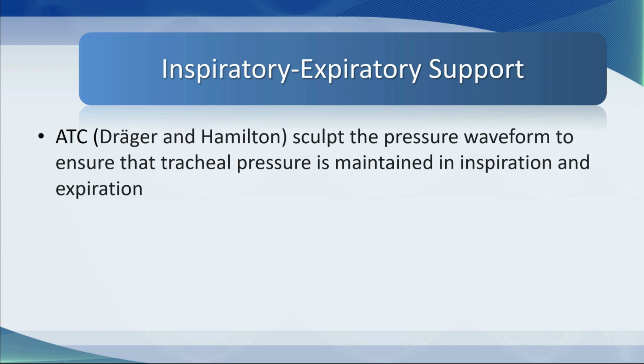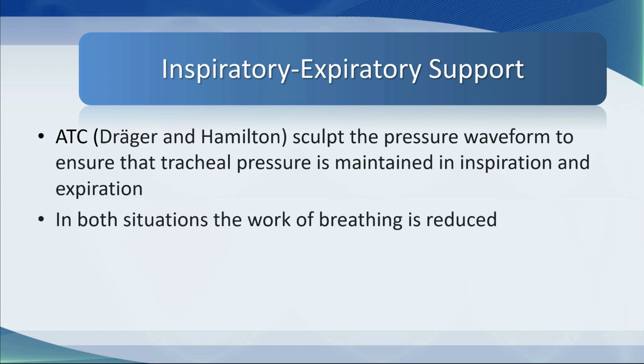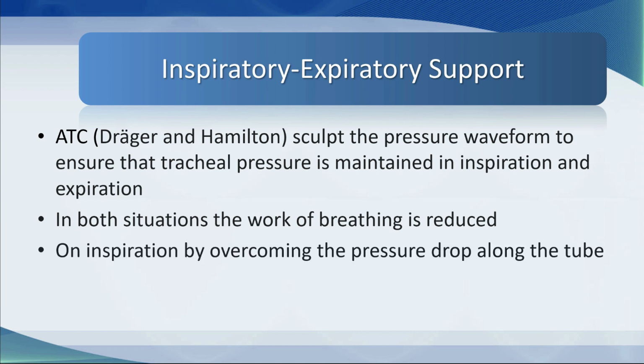On Draeger and Hamilton ventilators, ATC is a little bit more complicated because it sculpts the pressure waveform to ensure that the tracheal pressure is maintained in inspiration and expiration. And in both situations, the work of breathing is reduced.